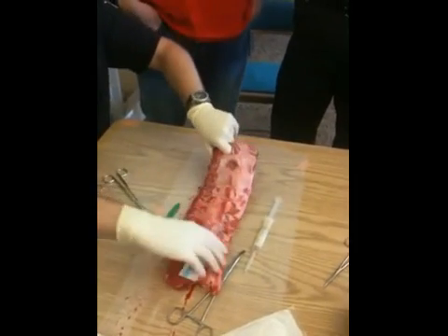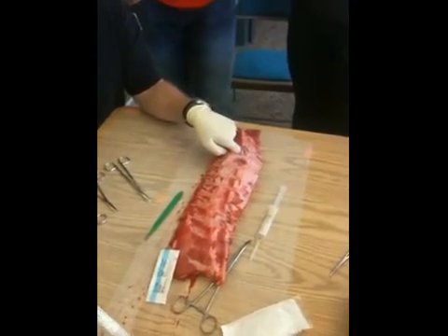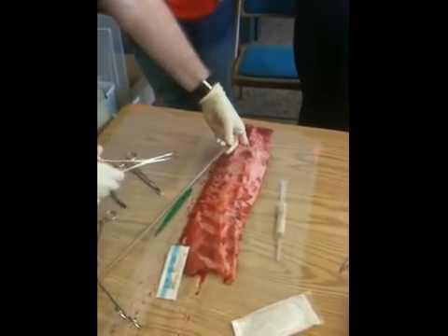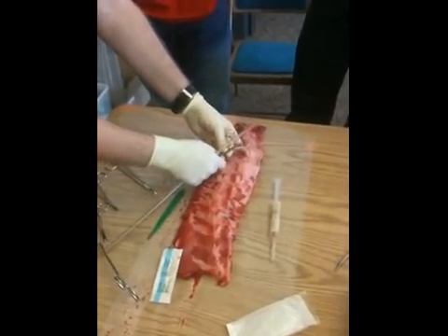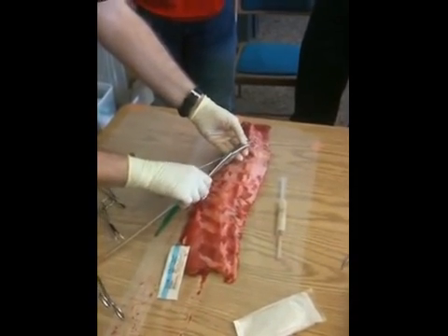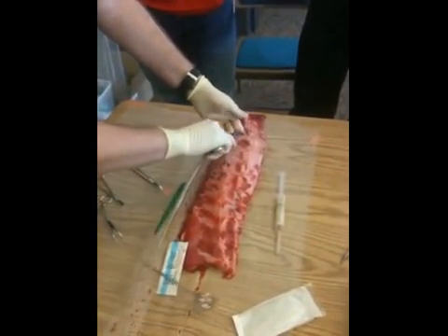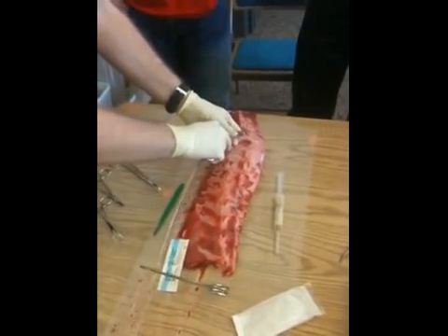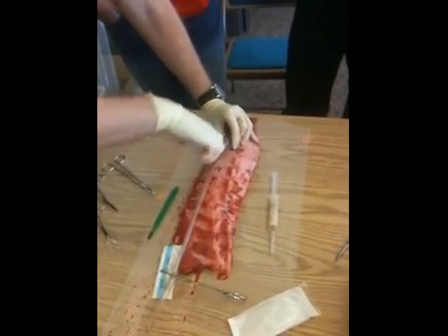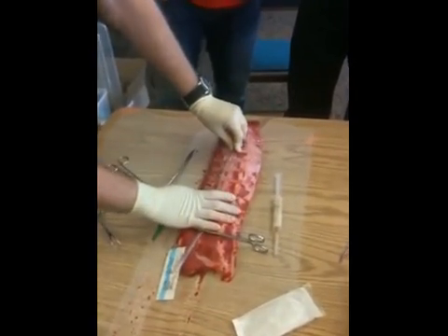Once I've done that, I will not take my finger out yet. I go ahead and have my chest tube ready. There are a couple of ways to insert it — you can use plastic chest tube guides, use your clamp as a guide to go in, or just put it straight in. It just depends on the situation. I go ahead and insert it, making sure that all my holes are in the chest. And I have my chest tube in.